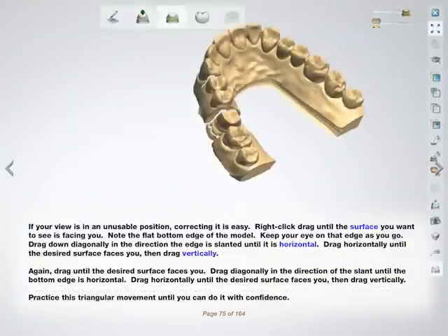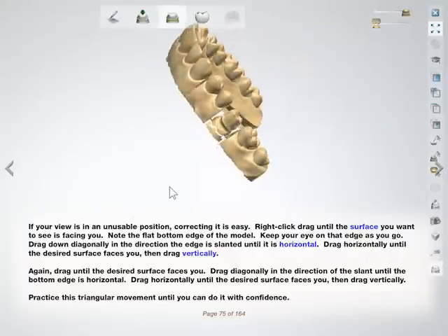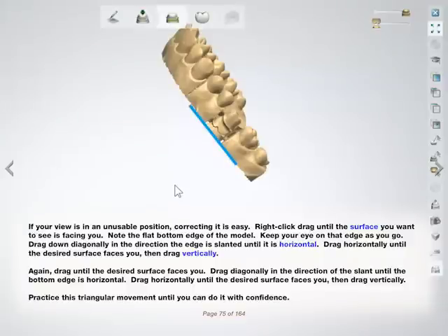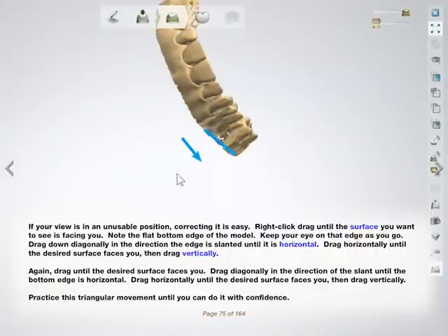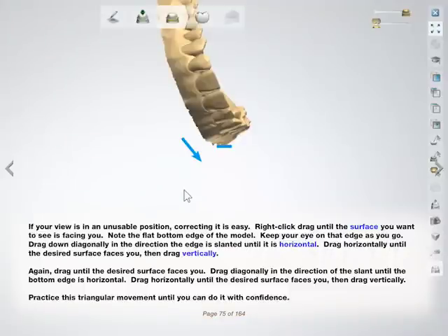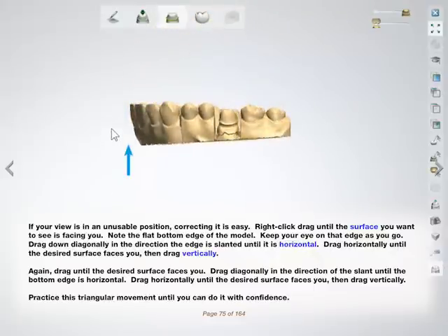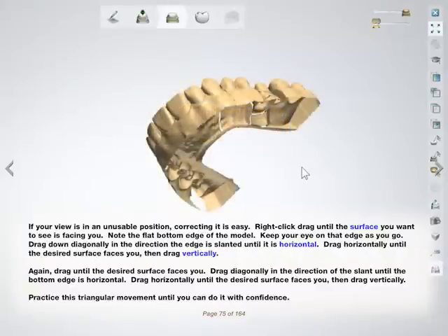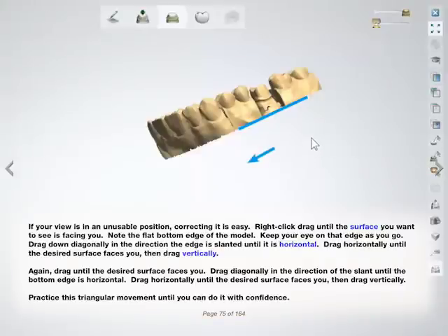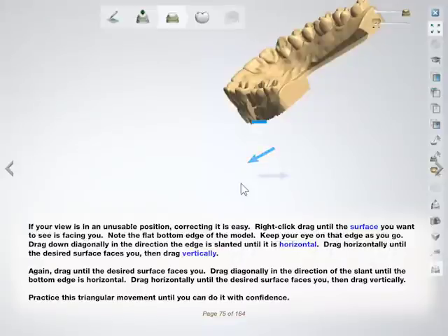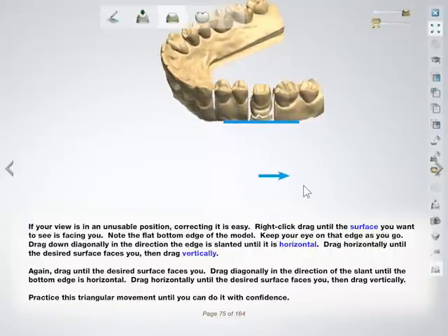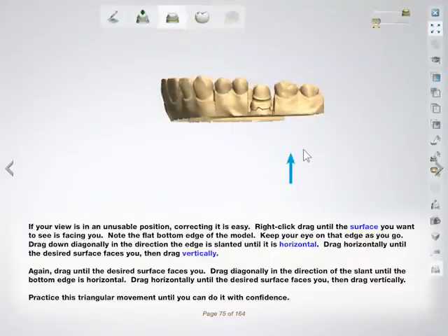If your view is in an unusable position, correcting it is easy. Right-click drag until the surface you want to see is facing you. Note the flat bottom edge of the model and keep your eye on that edge as you go. Drag down diagonally in the direction the edge is slanted until it is horizontal, then drag horizontally until the desired surface faces you, then drag vertically. Practice this triangular movement until you can do it with confidence.